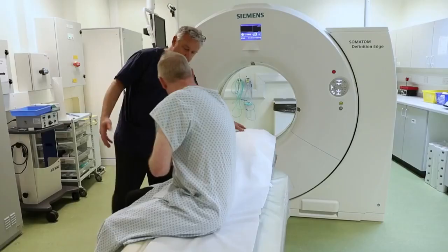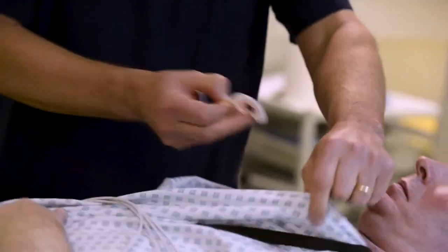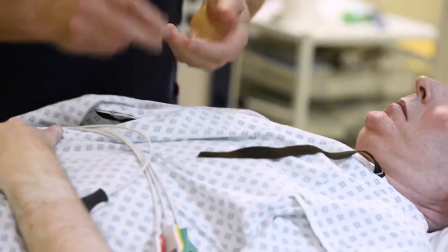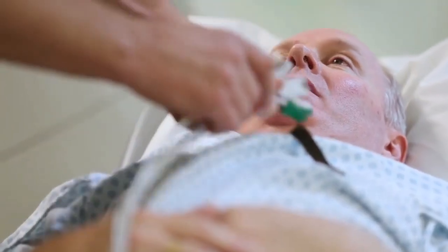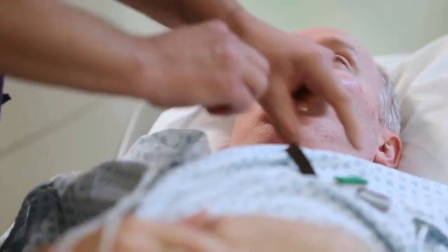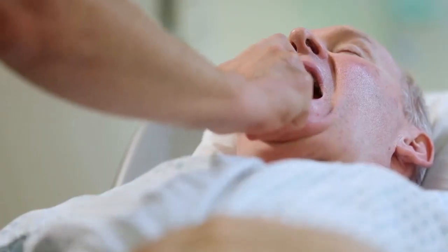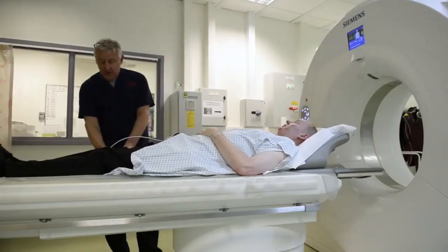Cardiac CT. A cardiac CT scan also takes pictures of the chest area. However, the focus is not on the lungs, but on a person's heart. A doctor might order a cardiac CT to detect problems with the aorta, heart valves, and other arteries. In some cases, a doctor might order a cardiac CT scan to follow up on the results of a procedure, such as a coronary artery bypass grafting.